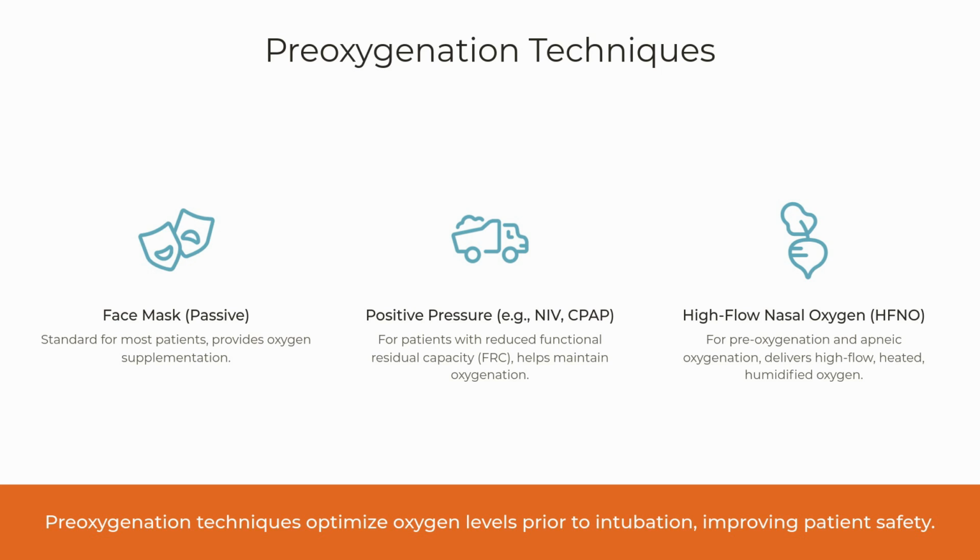There are several techniques for preoxygenation, each suited to different patient needs. The tight-fitting face mask with passive delivery is the standard approach, where patients breathe 100% oxygen for 3 to 5 minutes until end-tidal O2 reaches 90%. This works well for most patients without risk factors.